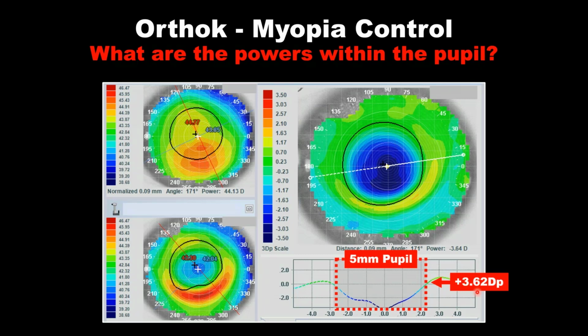And that's the way to slow down eye growth. So push the maximum plus. This is a really important understanding for us, this area within the pupil that Medmont defines to help us appreciate whether we've done a good job of creating an ideal myopia controlling outcome, not just a good bullseye.